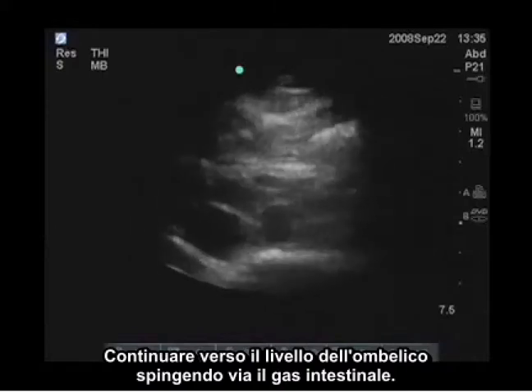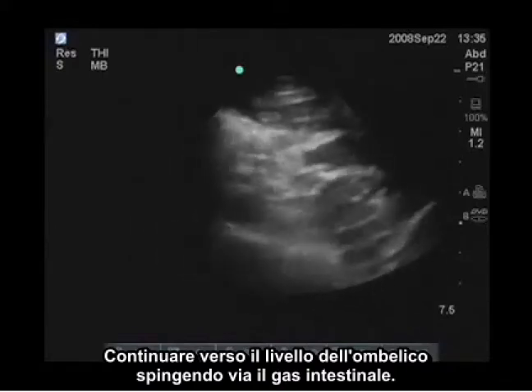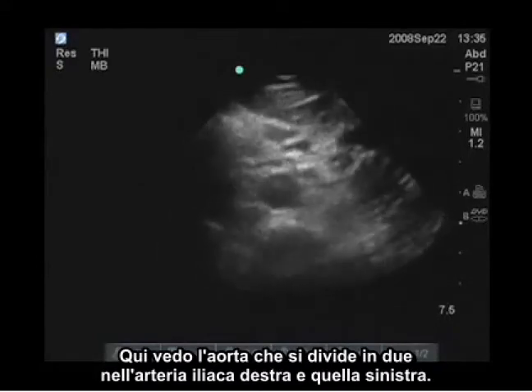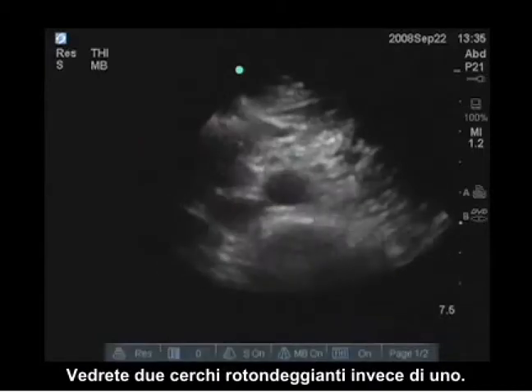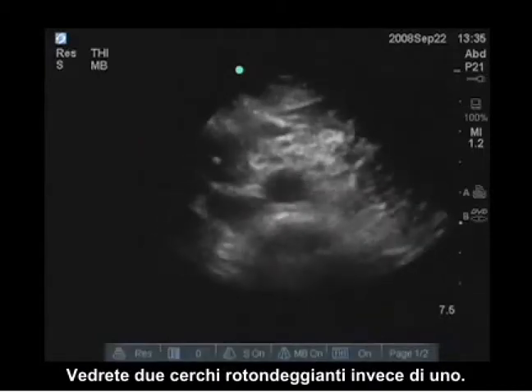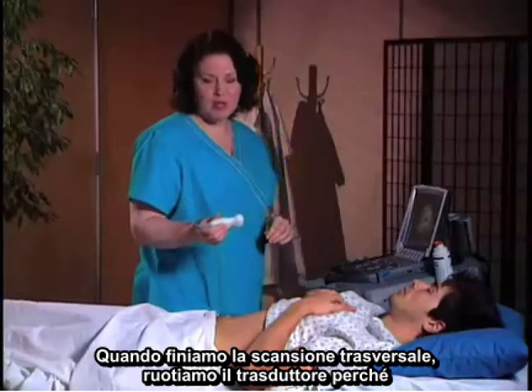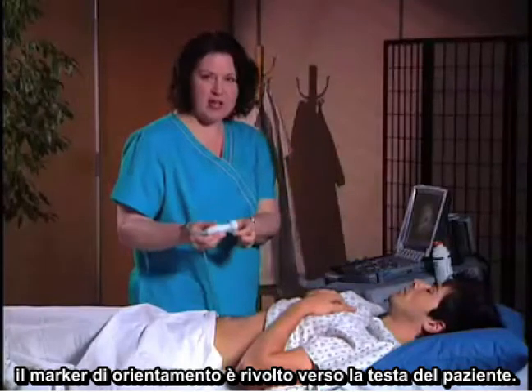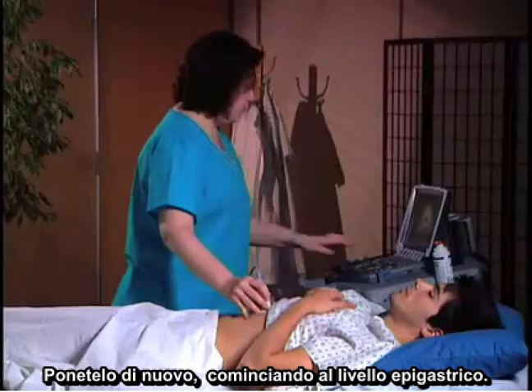I'm going to continue down to the level of the umbilicus, pushing away the bowel gas. And here I see the aorta divide into right and left iliac arteries. So now we see two round circles instead of one. Once we finish the transverse sweep, we're going to turn the transducer so the orientation marker is facing the patient's head. We'll place it again, starting at the epigastric level.